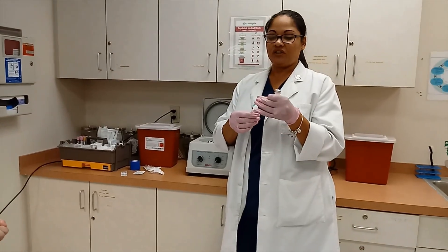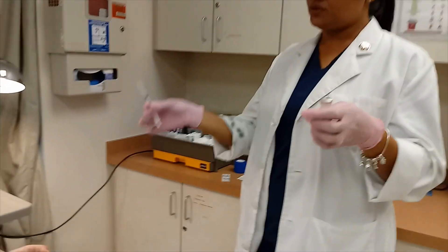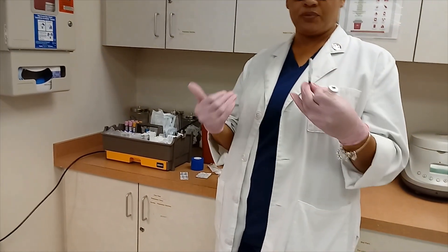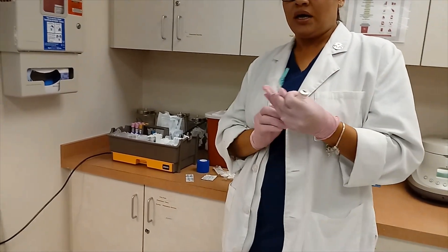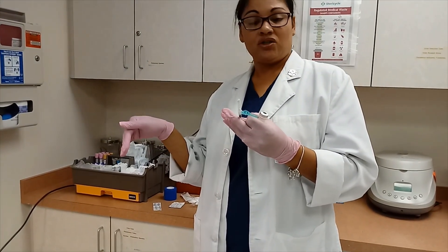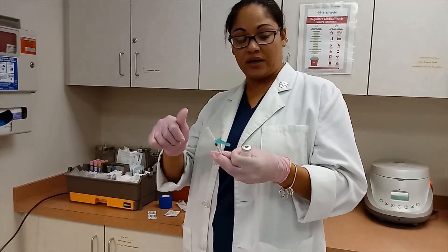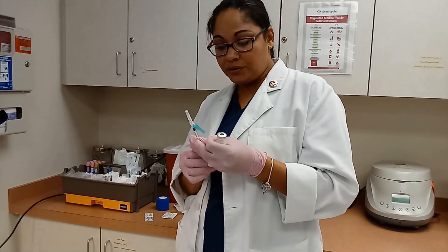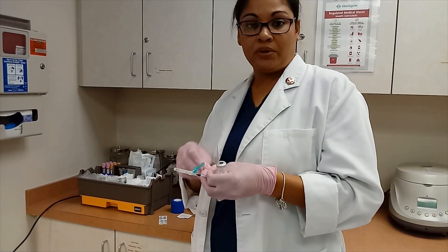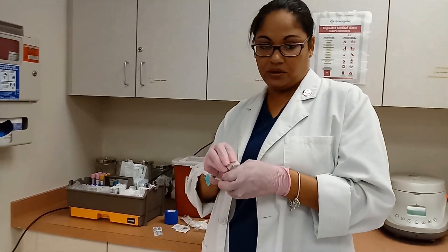We use a 27-gauge needle, which is a smaller needle. We're only going under the surface of the skin with the bevel — not going any deeper like we do for other injections. We're injecting 0.1 mL. One of the main things to remember about this injection is that you do not aspirate. We aspirated on intramuscular and subcutaneous, but this one we will not aspirate. We're just going to go in with only the bevel and inject. You have to get what's called a wheal — a little bubble under the skin, also called a bleb (B-L-E-B).